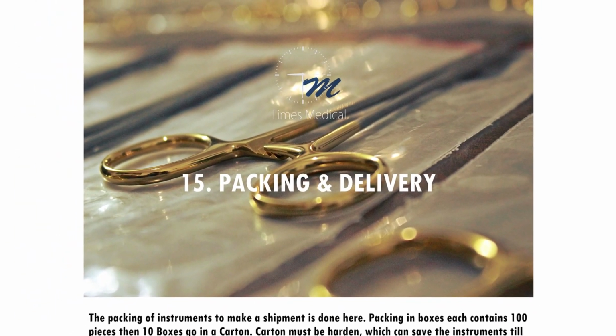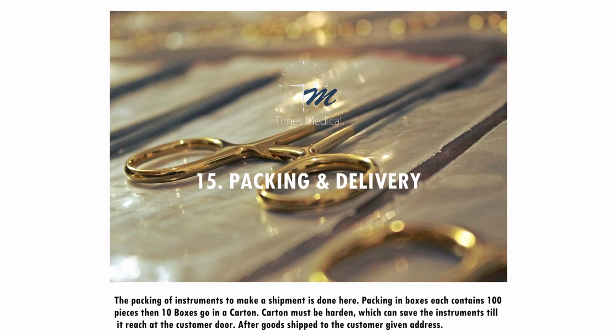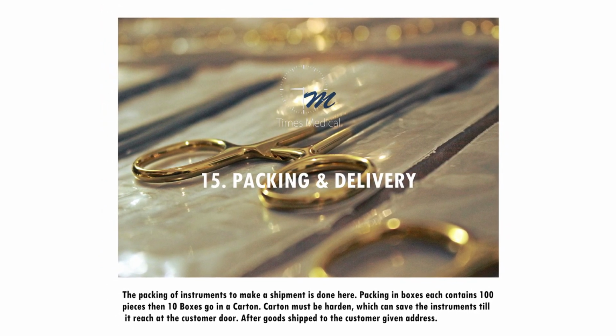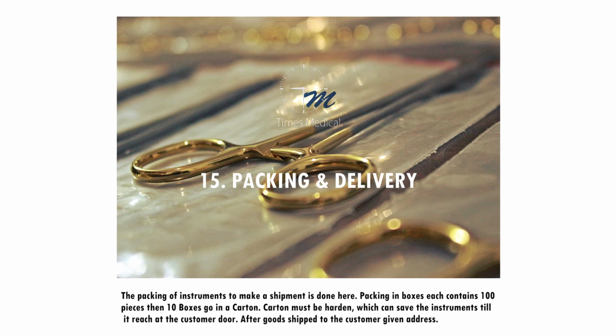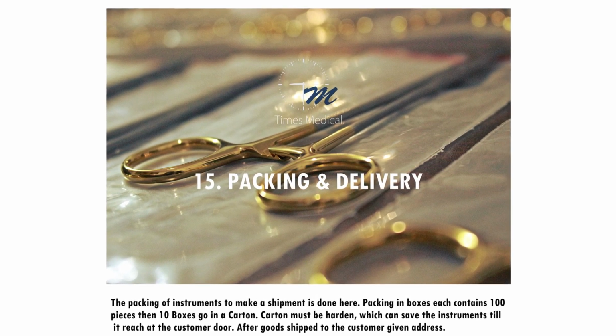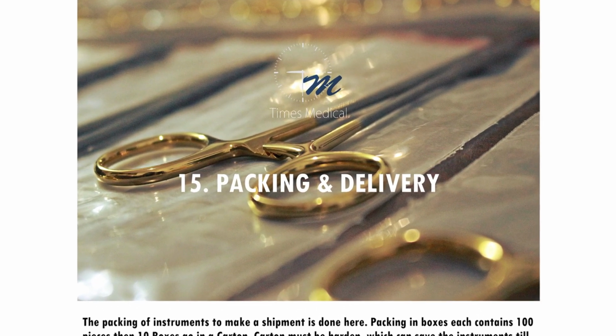The packing of instruments to make a shipment is done here. Packing in boxes. Each contains 100 pieces, then 10 boxes go in a carton. The carton must be hardened, which can save the instruments till they reach the customer's door. Goods are shipped to the customer's given address.